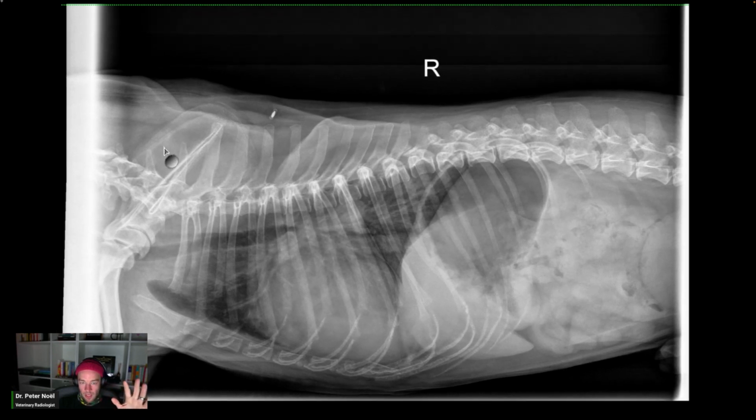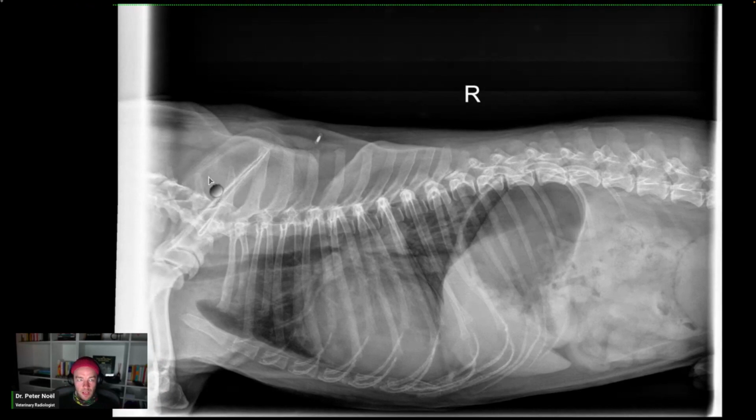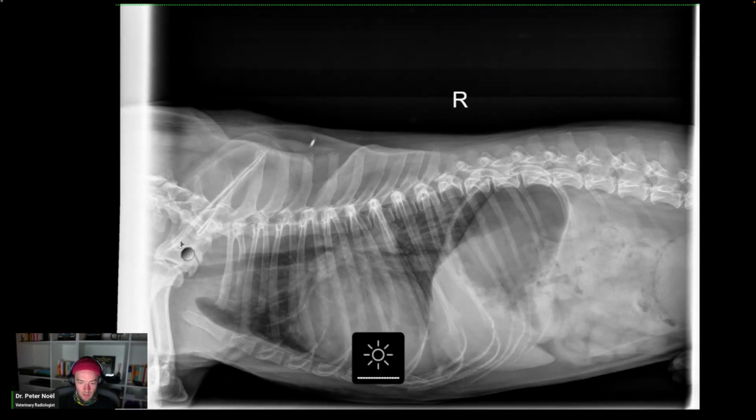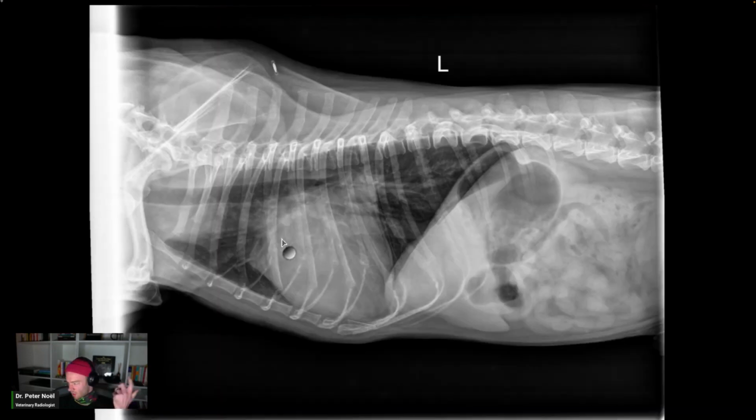Okay. First thing, we didn't really talk about technique. If you guys could do me a favor, these borders, I don't know if it's bugging you, but it bugs me because it's like trying to view the radiograph with somebody shining a light in your face. This is not bad, that one's great, but that's just an aside.